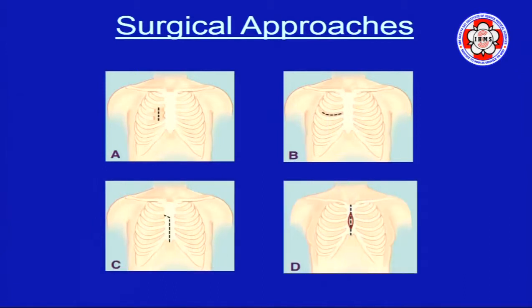So this is my least favorite. The most commonly performed is the midline sternotomy incision, and a right thoracotomy with a mini thoracotomy or a generous incision through the fourth intercostal space. And the lower hemisternotomy is another approach I use fairly frequently.